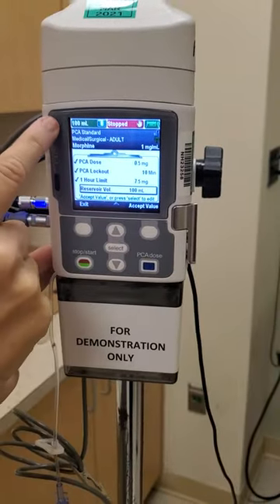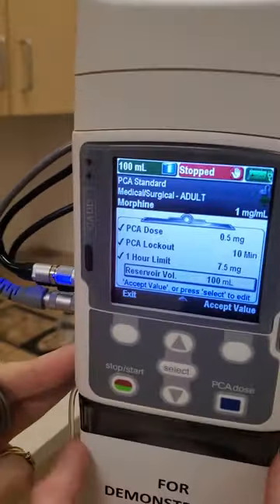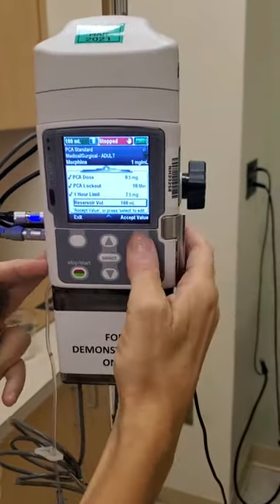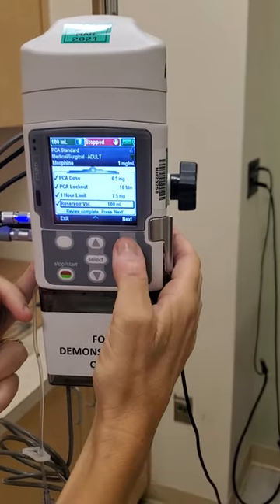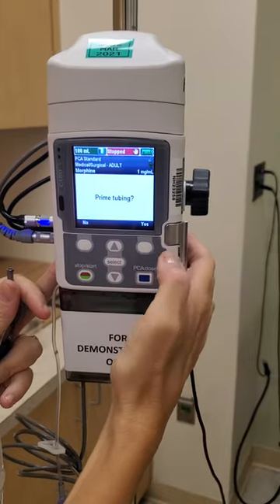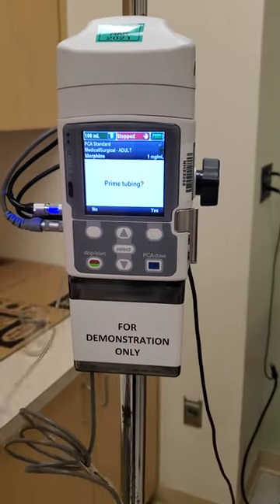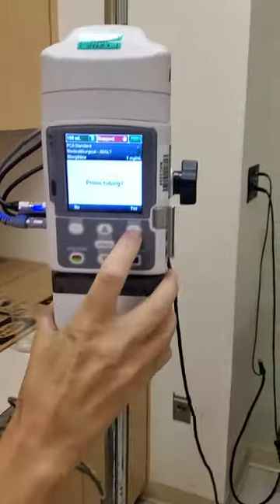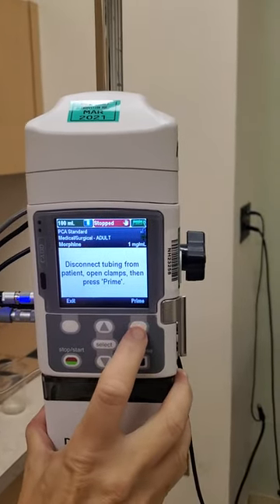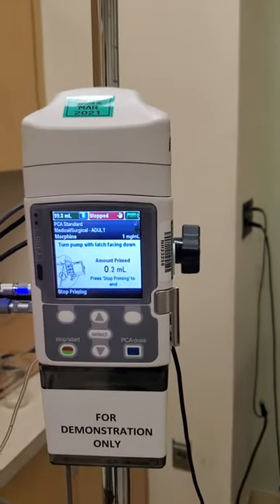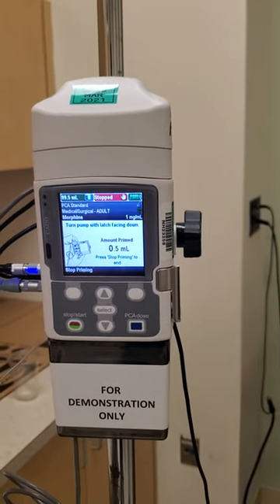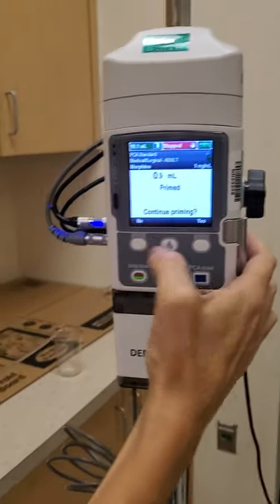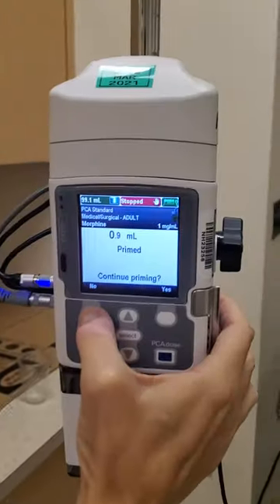The reservoir volume is shown in the right-hand corner and corresponds to what is in your cassette — it's also on your label and is usually 100 milliliters. I'll accept that value and press next. I've connected my tubing, so now I'm going to prime it. I'll hit yes and prime, watching the fluid go through until it comes out the other end of the tubing, then stop and say no — I'm done priming.